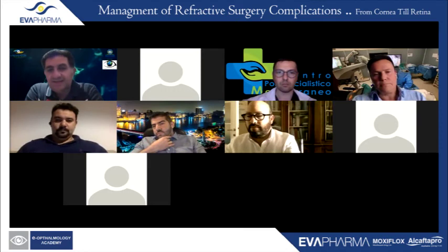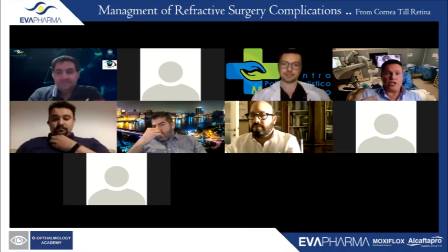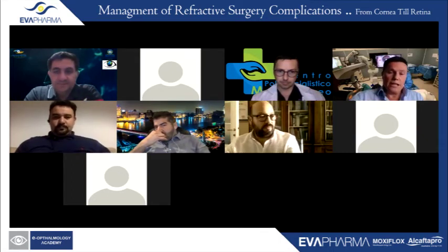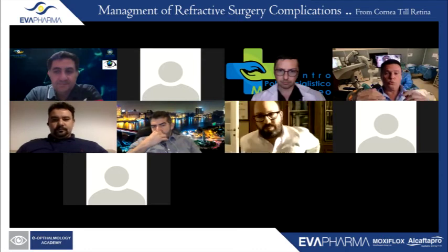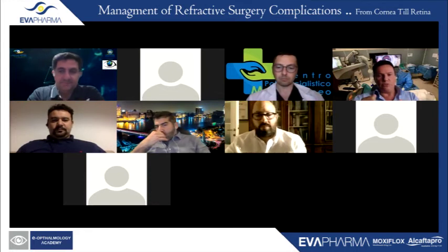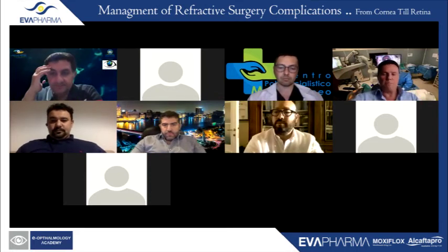What about ICL in children? Well, a very good question. ICL in children, I did it in a few cases. Very high myopes, I already did it, to lower the progression of the myopia, or in anisometropia. It works beautifully in anisometropia, and then afterwards I can wear glasses or contact lenses, of course. But in anisometropia and to treat amblyopia in those cases, it works beautifully.